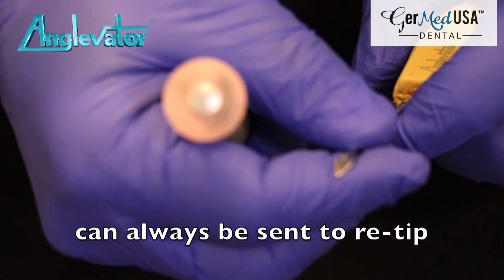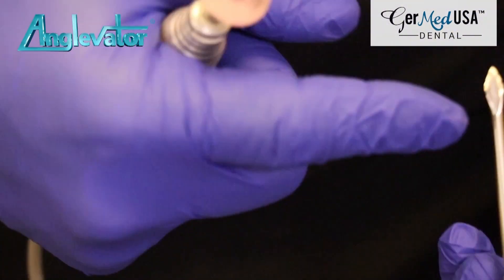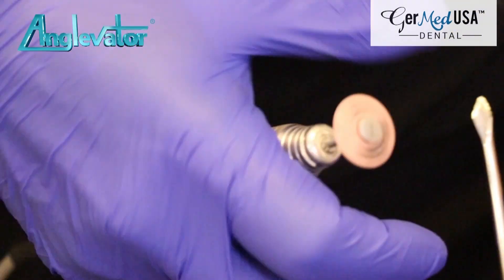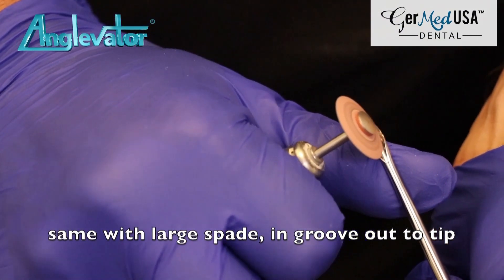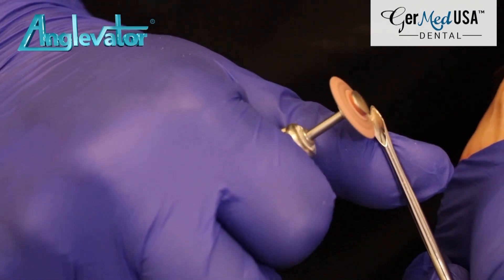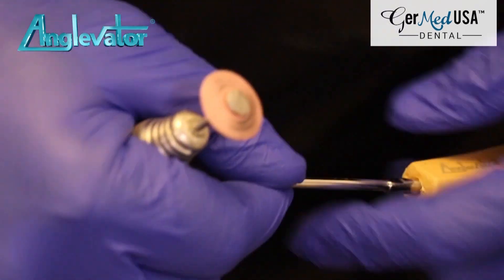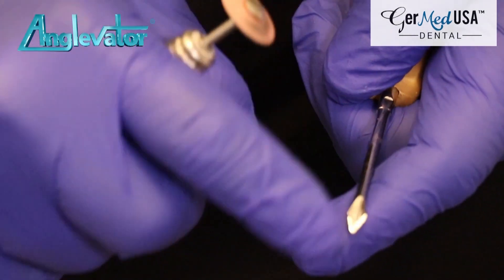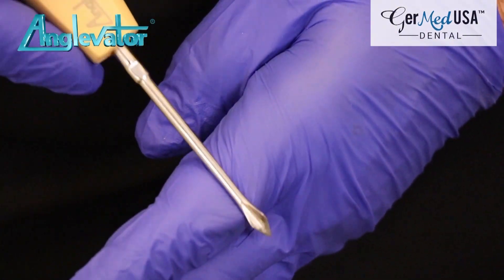Same thing on the large five angle, as you can see. You're going to go in the groove and out this way like this. And that will smooth, polish, and harden your tip. You want it smooth to be able to slip into the PDL just like a shoehorn.